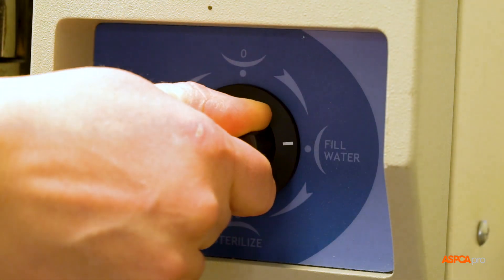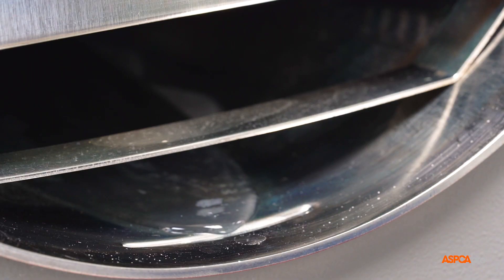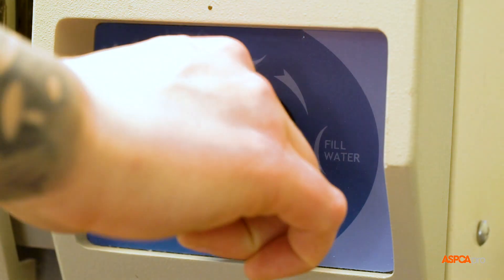Turn the knob to fill and watch the water until it reaches the designated line. Then immediately turn the knob to sterilize.